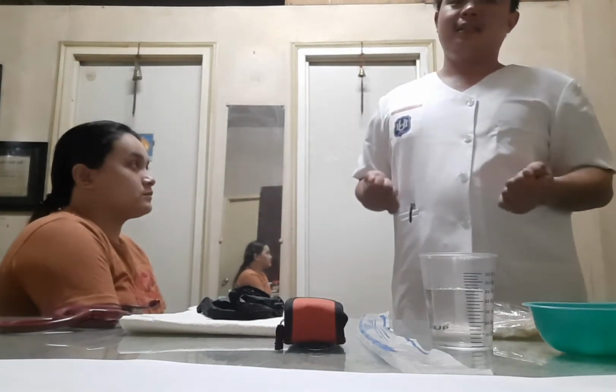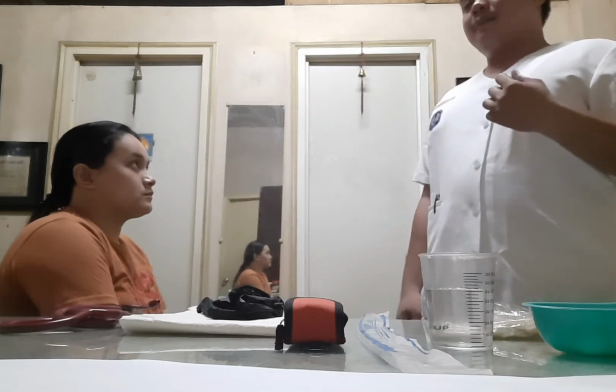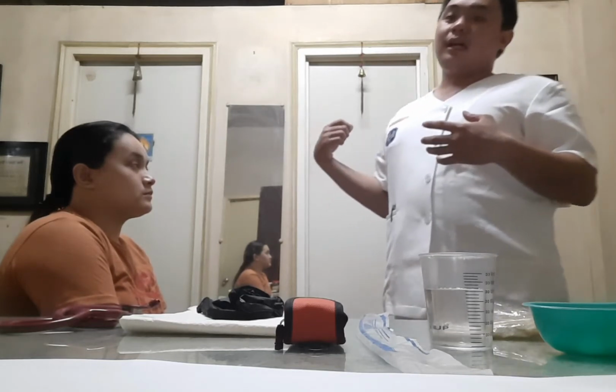Assuming that I already done proper hand washing, I will be giving the patient's privacy by closing the curtains or the doors or the windows and anything that the patient can be seen through outside of the room.